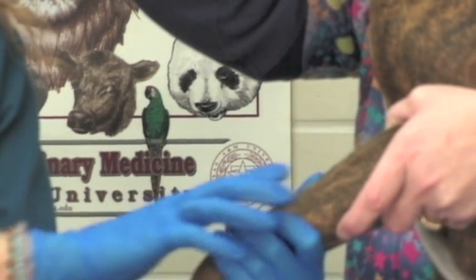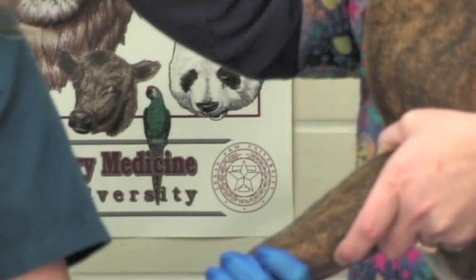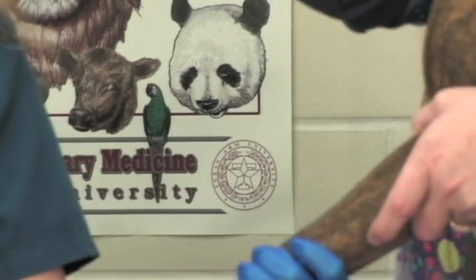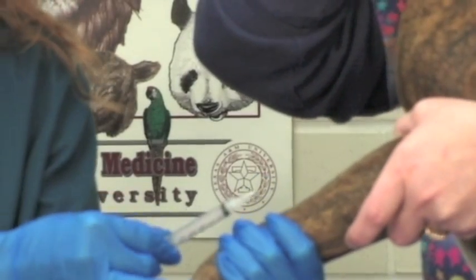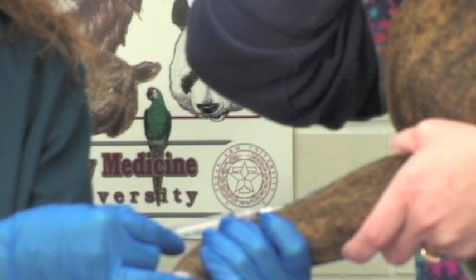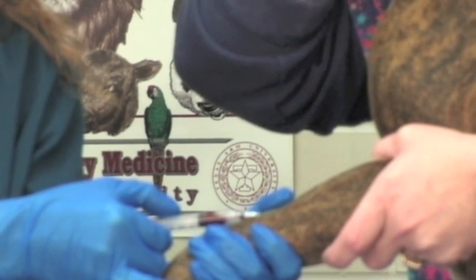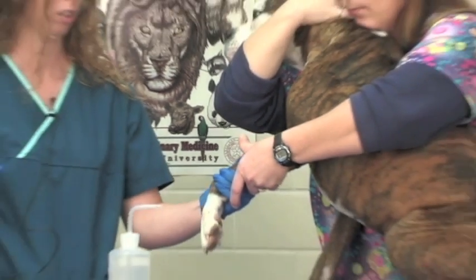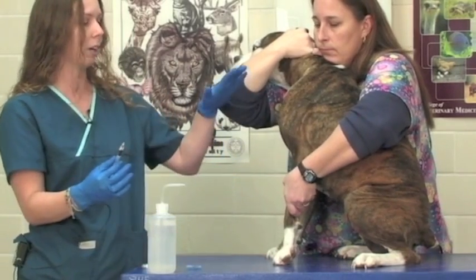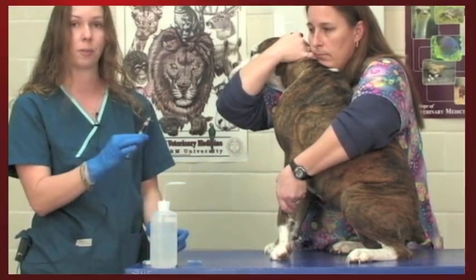You can palpate the vein. When you draw blood with a needle and syringe you want to enter the skin at about a 30 degree angle with the bevel of the needle pointing up. We're going to enter the skin at about a 30 degree angle and then pull back gently on our plunger. We obtain the right amount of blood needed for our blood test, then gently place our finger over the needle, remove the needle, and hold off the vessel because we've now poked a hole that needs to seal off. Her body is now sending platelets and clotting factors to that tiny hole.